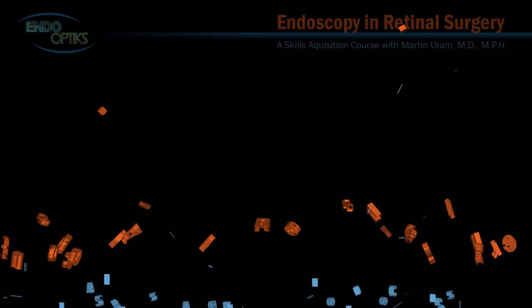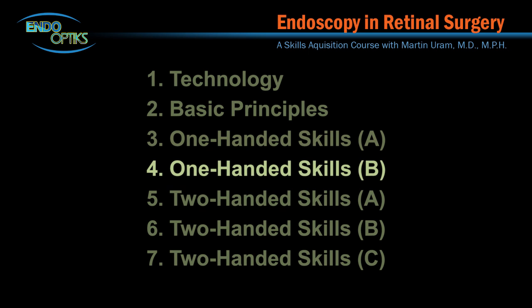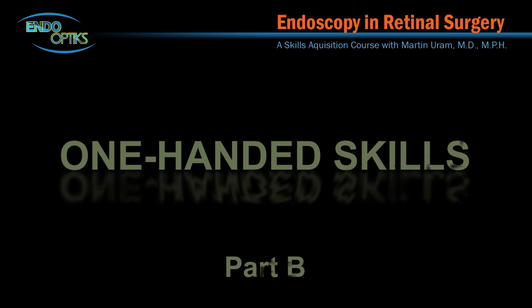Many endoscopic techniques can be performed with one hand. Their purpose is to look around for pathology or deliver laser energy. These maneuvers are relatively simple and can be executed by most surgeons at their first attempt.